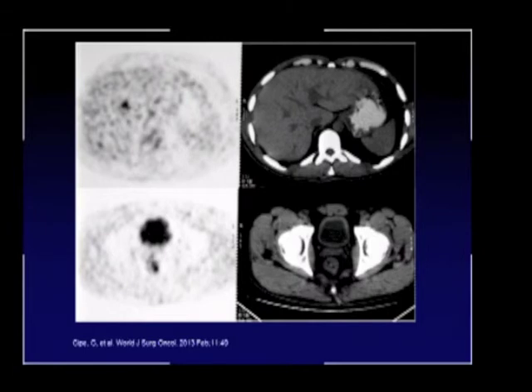This is an example from that second study I mentioned. You can see in these PET-CT images, this patient had no metastases on conventional imaging, meaning CT scan, and had a follow-up PET-CT scan which showed this FDG avid nodule in the rectum, and then a solitary metastasis in the liver, which was not detected on imaging earlier, and probably because it lies right on the hepatic vein. But patient management changed based on this finding.